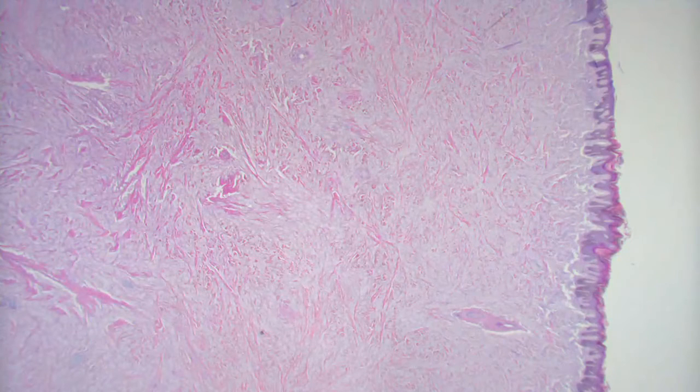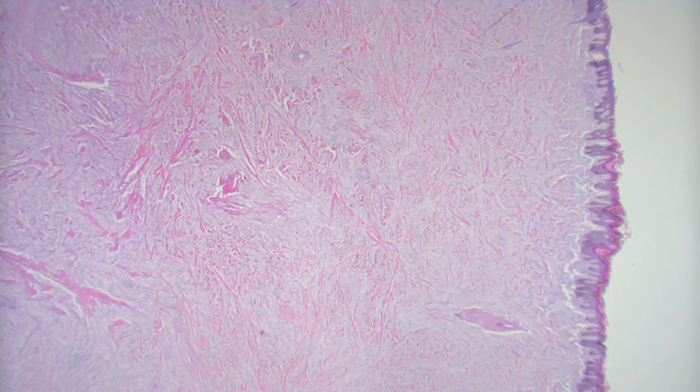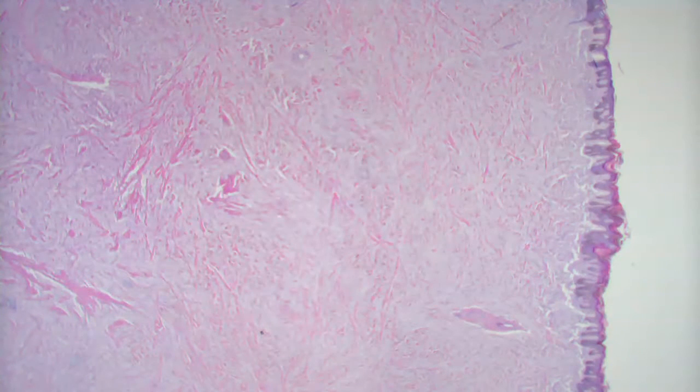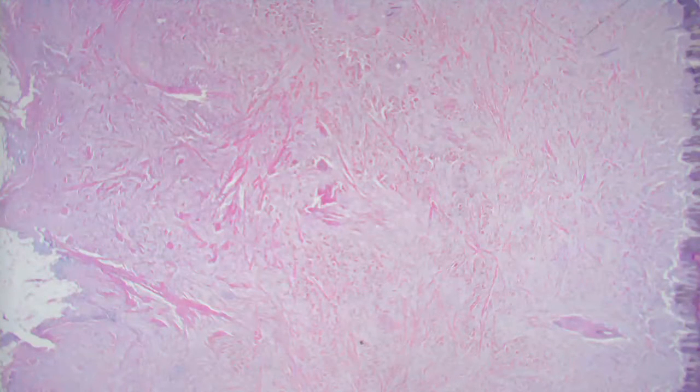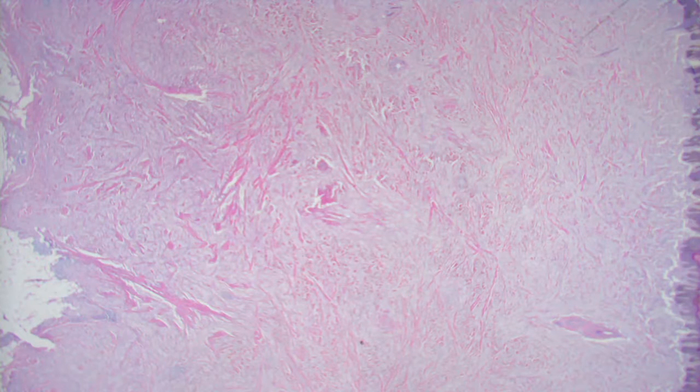Alright, so here we have a punch biopsy. It looks like most of our pathology here is in the dermis. If you go on higher power, do you think it's an inflammatory or neoplastic process? It's a neoplastic process. Benign or malignant? Benign. Okay, yeah, it's benign, but is it small? No, it's large. So it kind of breaks one of the rules. Big, but it's very well circumscribed and beautifully symmetrical.